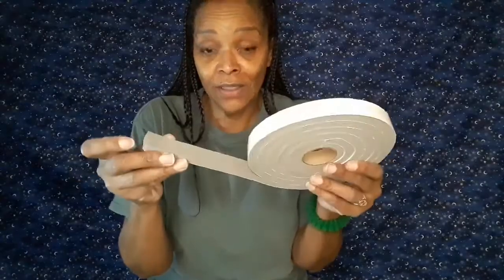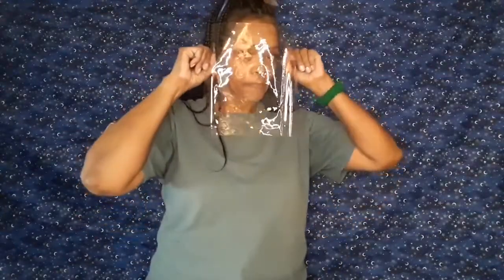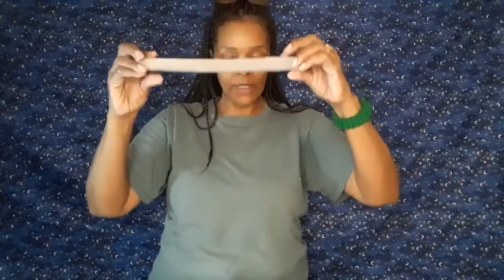Foam window seal. This adhesive is awesome. So what you do is you cut your vinyl, and I've cut this vinyl 11 inches around by 9. And then I cut a piece of the foam window seal 11 inches.